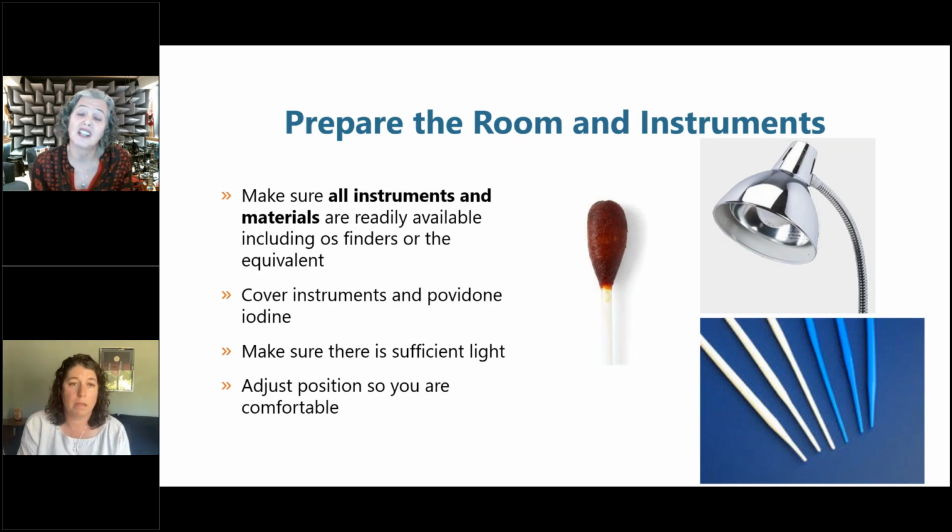Make sure there's sufficient light. One of the things that's going to be the best solution when you're not able to get through an internal os is to have a better light source, have the speculum be able to be opened wider so that you're able to see better and have more light coming in. Sometimes the difficulty is really just because the light source is inadequate. And making sure that you are comfortable, because hopefully you're going to be placing more than a couple of these in a day, and you want to be able to be as comfortable as possible so that you can be fully present there for the patient.